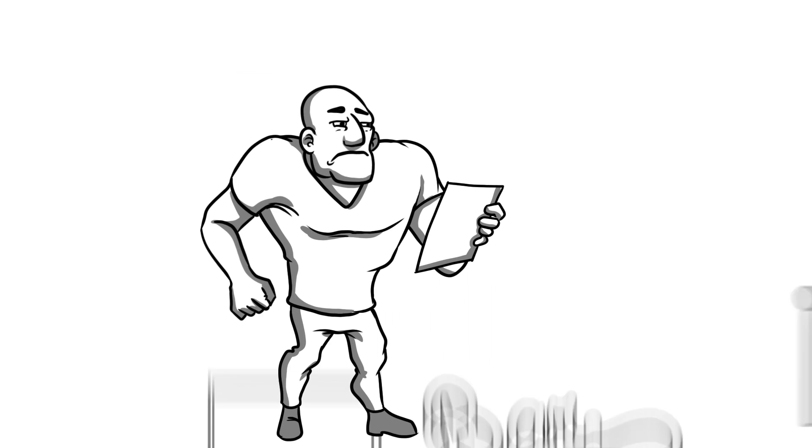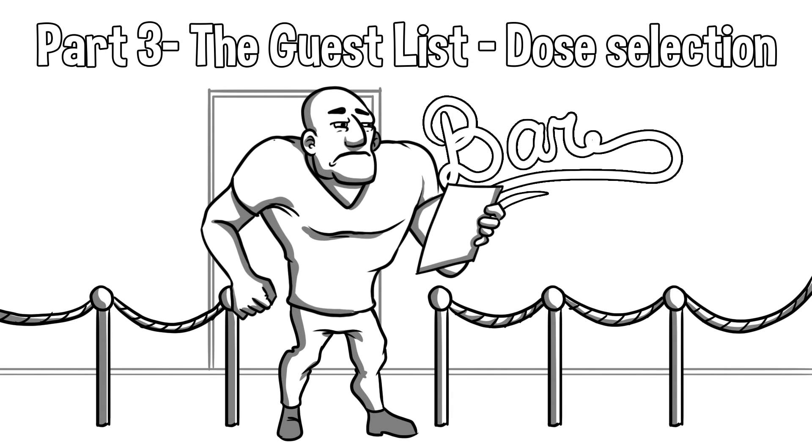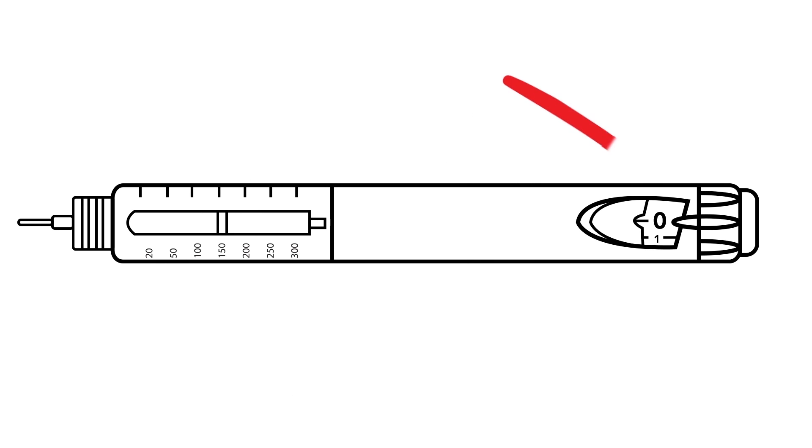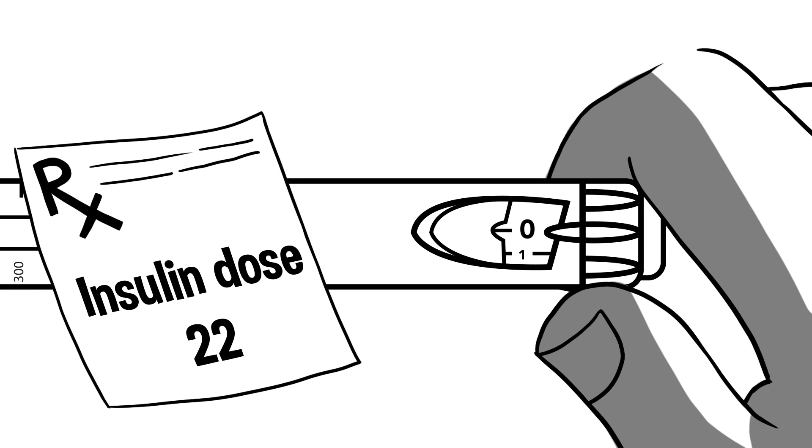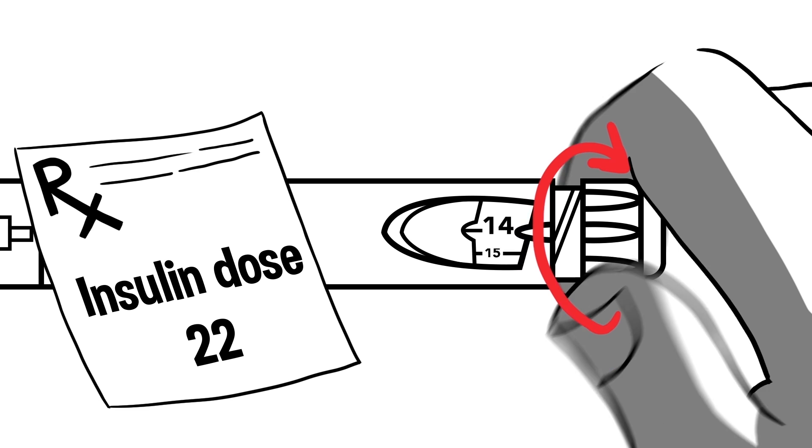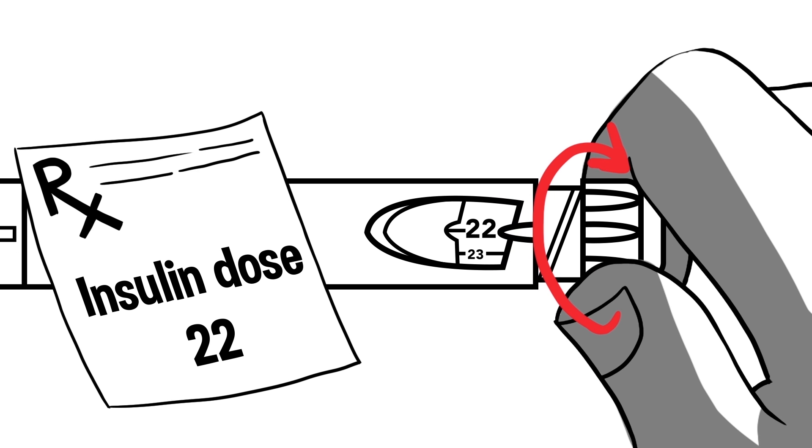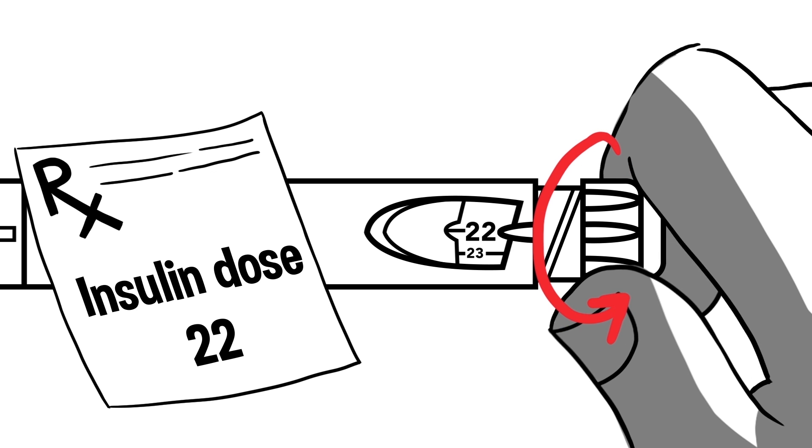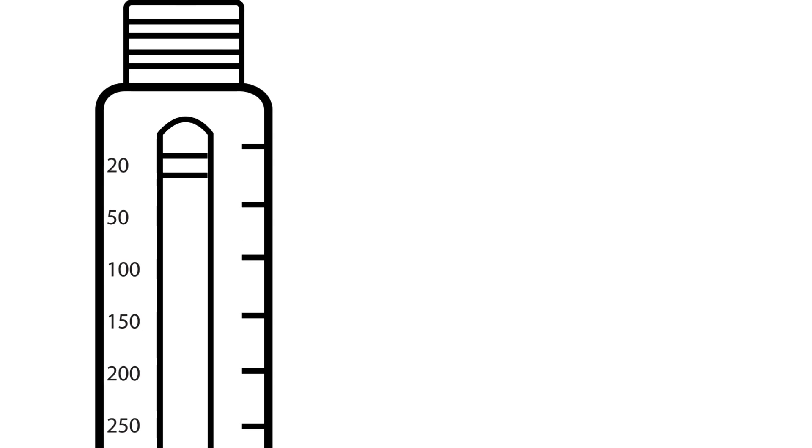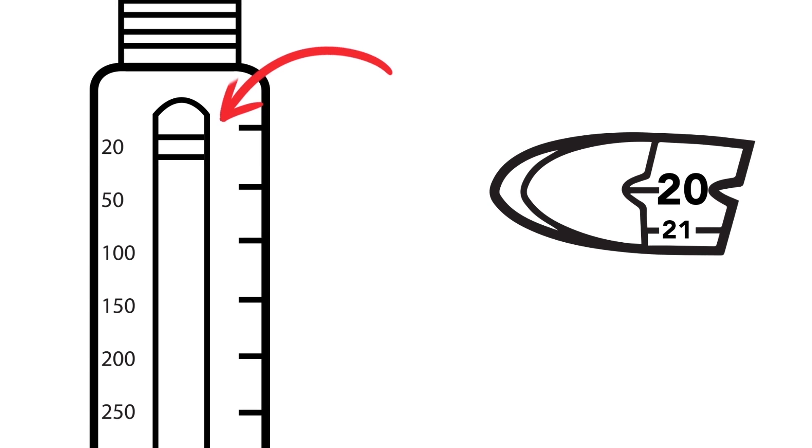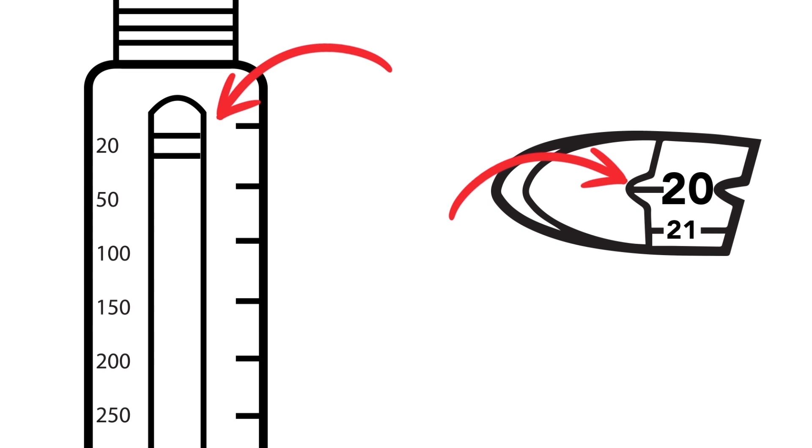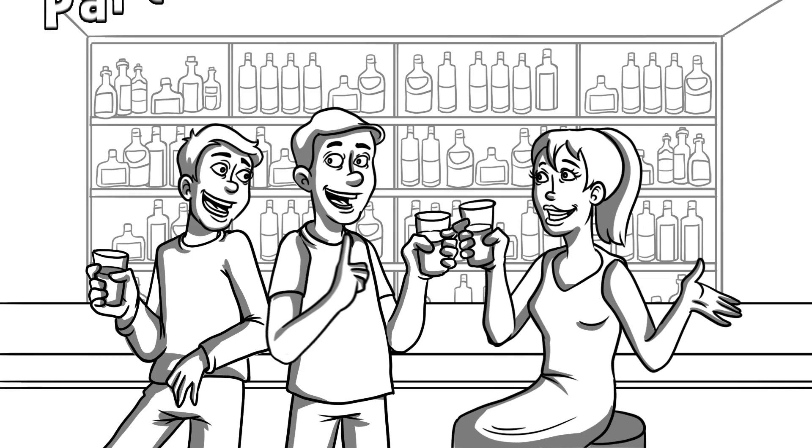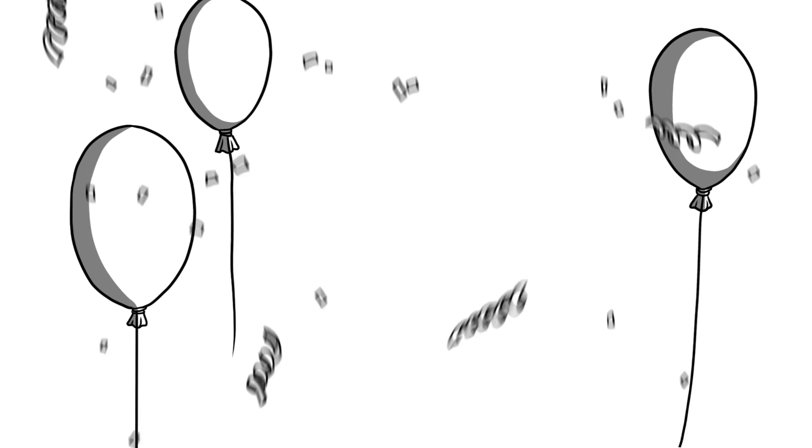Part 3 The Guest List. Dose Selection. The dial should read zero after the test shot. We dial the dose prescribed by your physician in the same way we dialed the test shot. Turn the knob clockwise until the pointer lines up with your prescribed number of units. Before injecting, the dose can always be corrected by dialing up or down if you happen to dial the incorrect amount. Keep in mind, if the amount of insulin in the pen is running low, it will only allow you to dial up to the amount that remains.